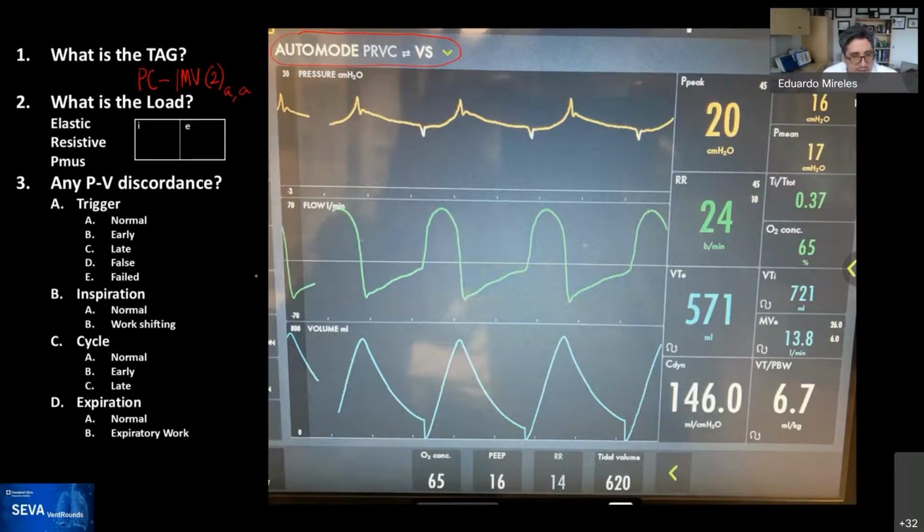Okay. Is that fair? The original IMV type 1 was designed so that you can set a frequency for the mandatory breaths, and you will always get them regardless of what the patient does. But the patient can also take as many spontaneous breaths as they want in between the mandatory breaths. It was originally designed to be a weaning technique, but it was shown to actually prolong weaning, because it takes people a long time, every time they go to rounds, to decrease the IMV rate and let the spontaneous rate take over for the patient.